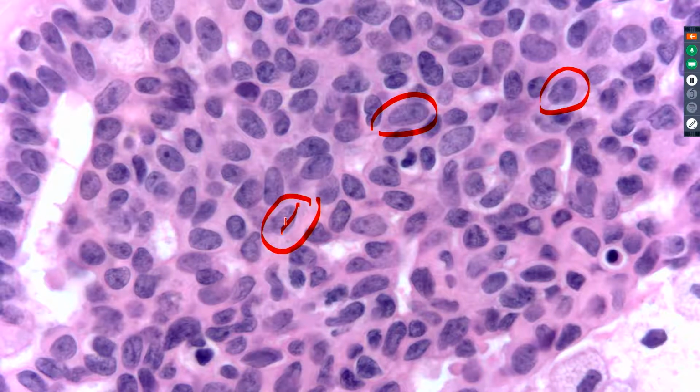And you can also see these nice nuclear grooves. There's one right there, and there are other grooves and folds in the nuclei. You also get these teardrop shaped nuclei with kind of a narrow end and a wider end, and that's very common in hyperplastic populations to have these slight narrowing or teardrop shaped nuclei intermixed with the more oval nuclei. The chromatin is euchromatic, so it'll be very similar to that of the neighboring luminal cells in the unremarkable epithelium in terms of how darkly it's staining. And there's usually a light granularity to the chromatin, as we're seeing here, with small nucleoli.